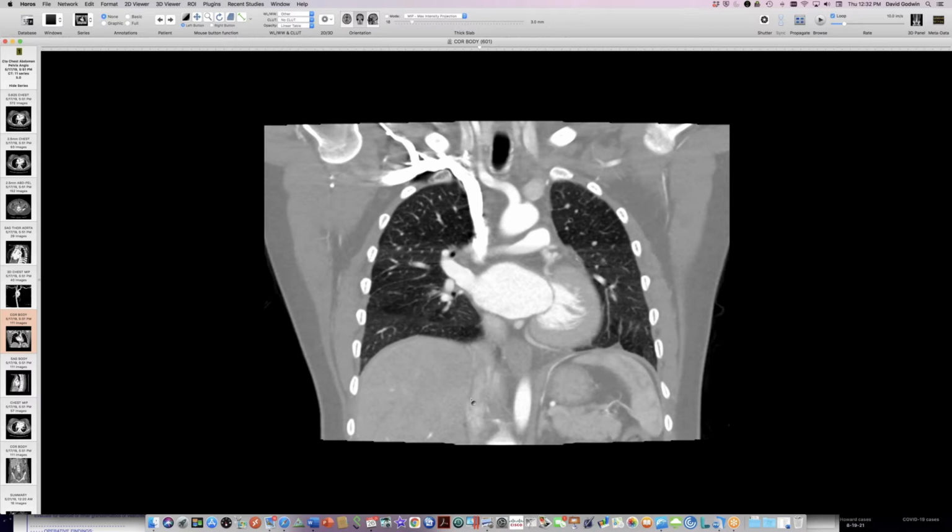It was definitely abnormal, but I wouldn't have called it CPAM. It didn't look that bubbly. And the cyst in the mediastinum, they are classifying as an esophageal duplication cyst, not as a bronchogenic cyst. So the experts disagree with the classic radiology in that case.